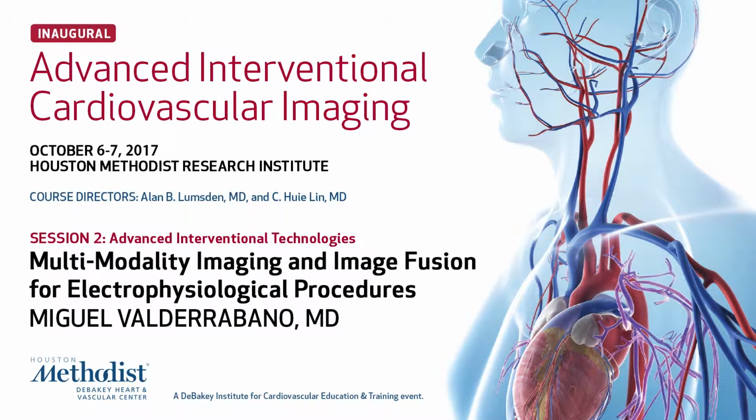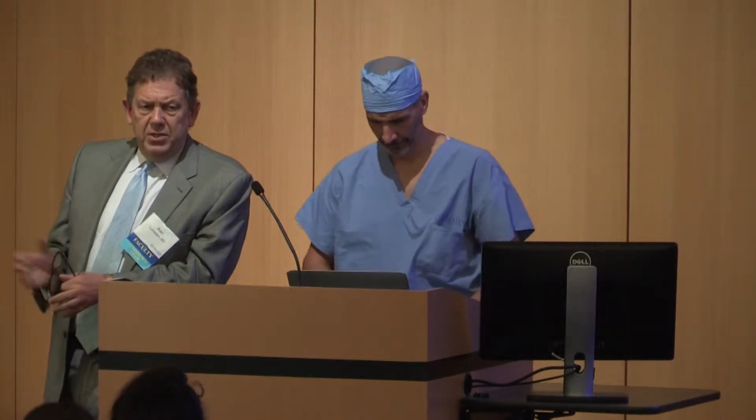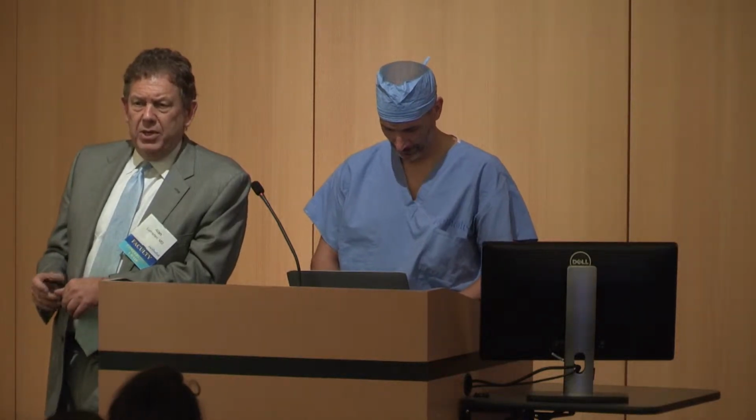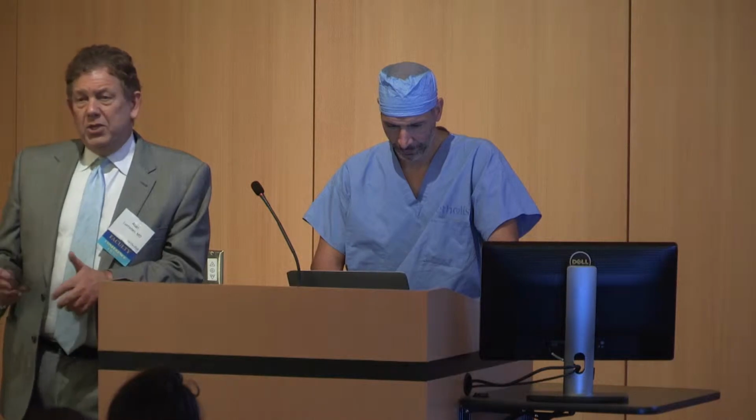I have to say, watching the EP guys at work is probably what stimulated us most to start thinking about multimodality. Walking into his lab one day, they had imported a CT scan of the left atrium. They were using the original Magellan Sensei robot to do ablations, while using a force sensor to know how much pressure they were applying on the wall of the left atrium, and at the same time doing electromechanical mapping, basically, of Lord knows what it was they were actually measuring. So they're bringing all of these different modalities in to improve the accuracy of what they were trying to do. And so again, I'd say a lot of the stuff is out there.